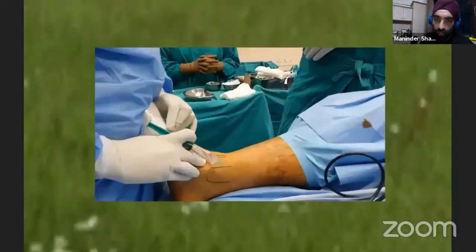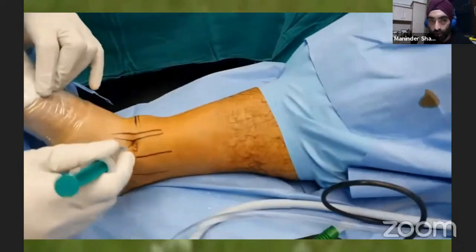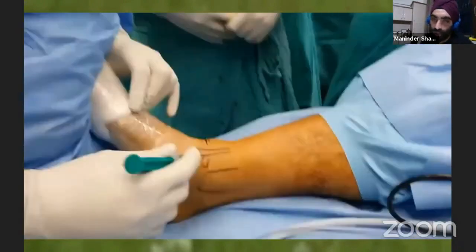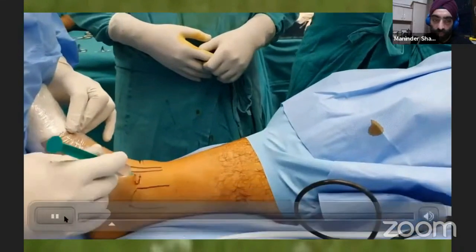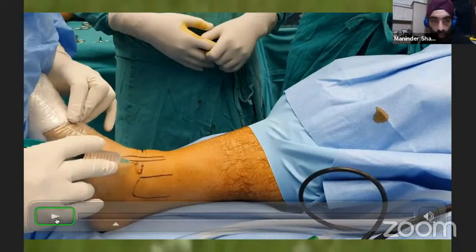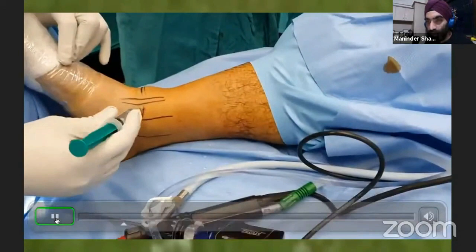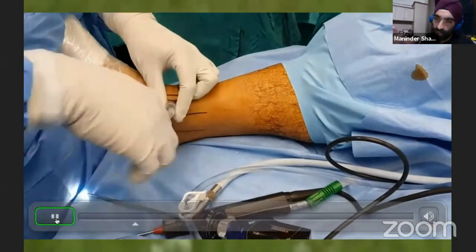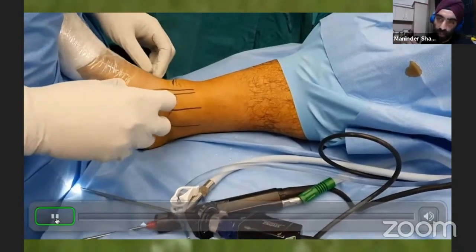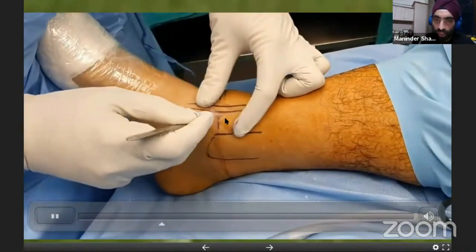This case has no deformity of the ankle, which is a bonus. However, the space in the ankle will be very limited arthroscopically, so you have to work from front to back and must use traction. The portals are standard. Initially without traction, I use my abdomen to position the foot, dorsiflexing and plantarflexing as required. Distend the joint with 5–10 ml of fluid so when you insert the scope you don't injure the surface.